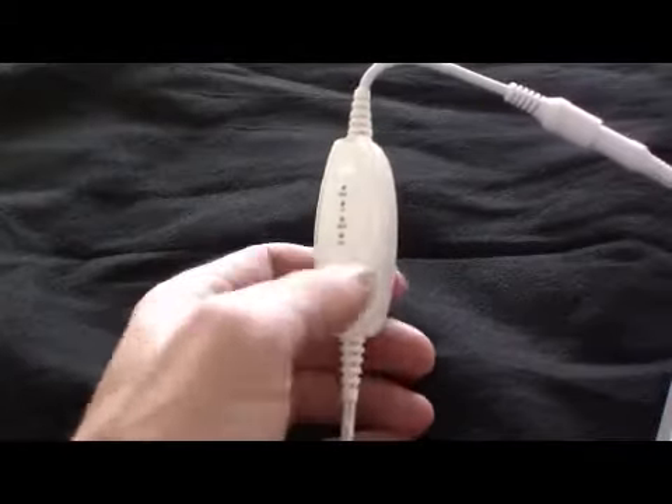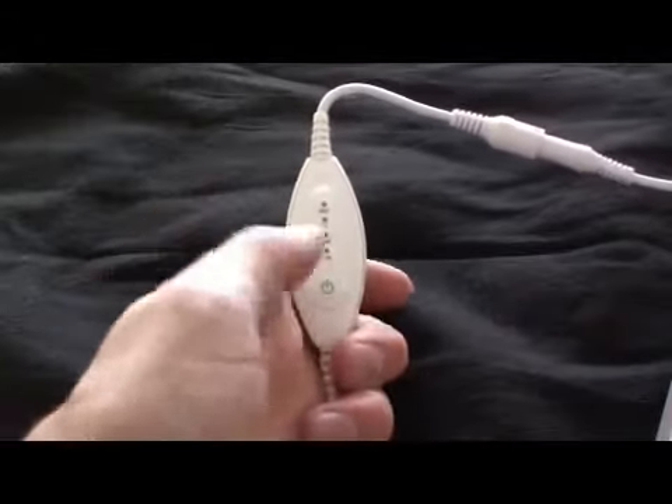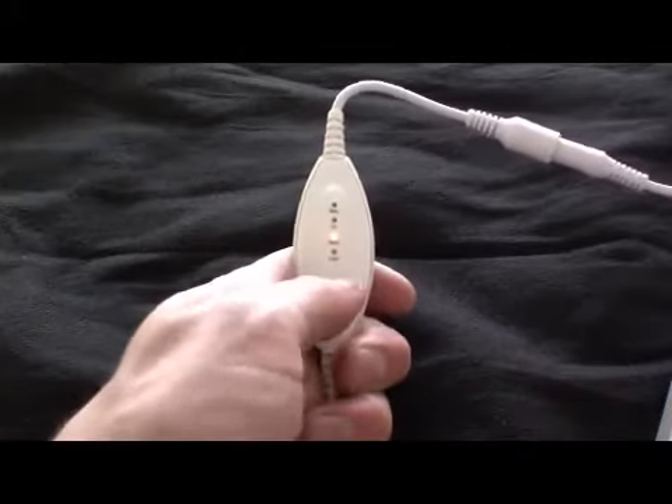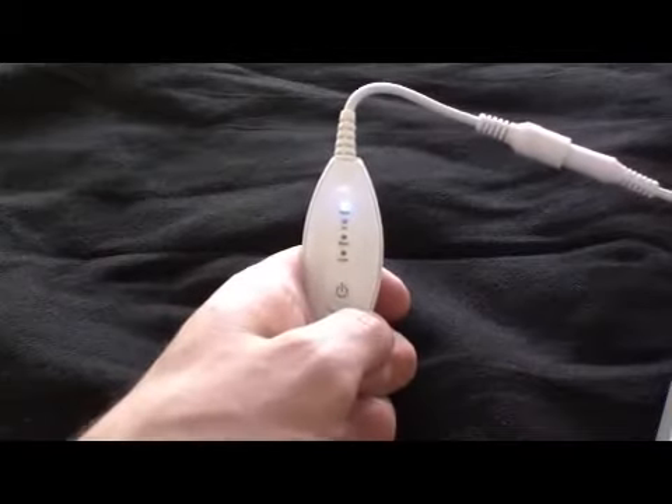To turn the heat on, press and hold the power button on the controller for two seconds until a yellow light appears, indicating medium heat. This is the default setting. To adjust the heat to the appropriate level of comfort, press the power button to cycle through the four heat levels.